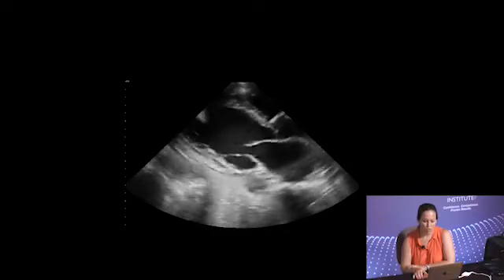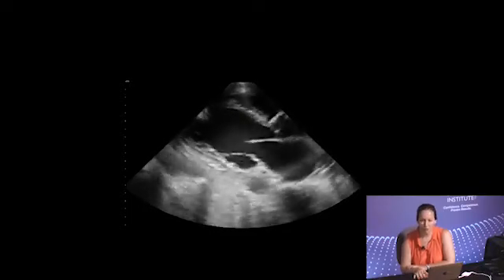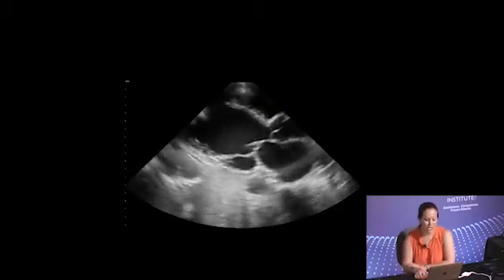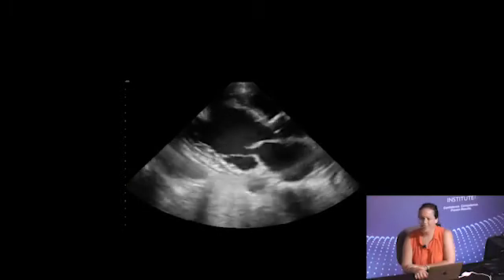It's a little bit slow, right? You're like, oh, I just want that heart to move. Like I feel like you just want to give it a push, right? So it's not doing a whole lot. Now, what's the thing that you notice really more than anything?